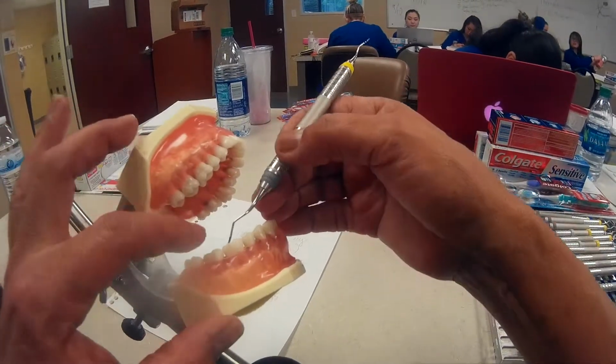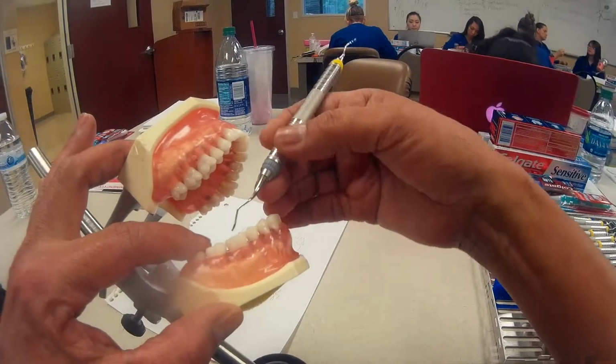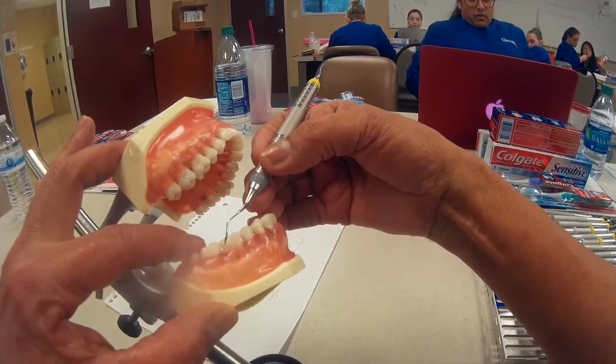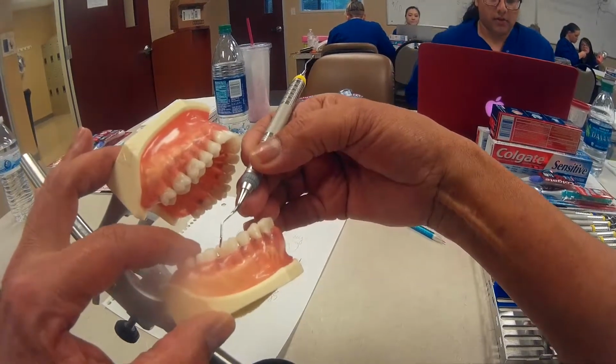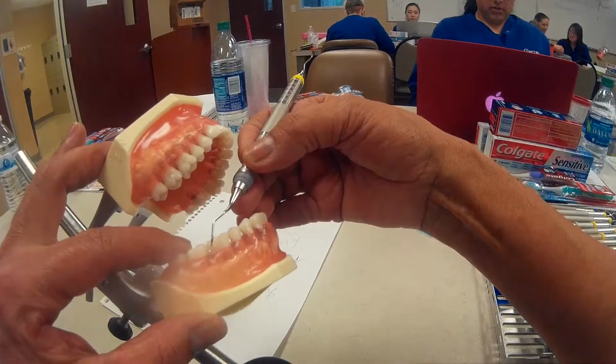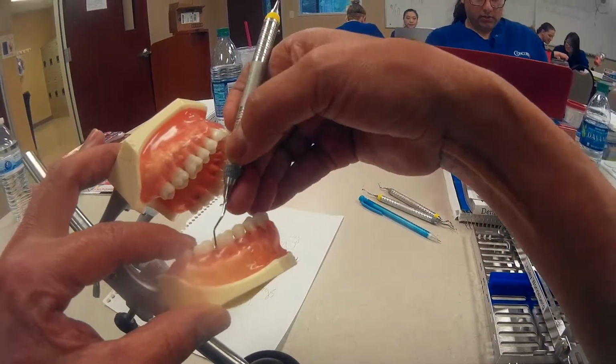So my get ready zone is right here on the distal buccal line angle. I'm going to drop the handle. I'm going to hug the tooth so it goes in a little bit. And again, this is a little curvier, so it's not as easy to keep really flush. Okay, but like this, so the back end goes in.